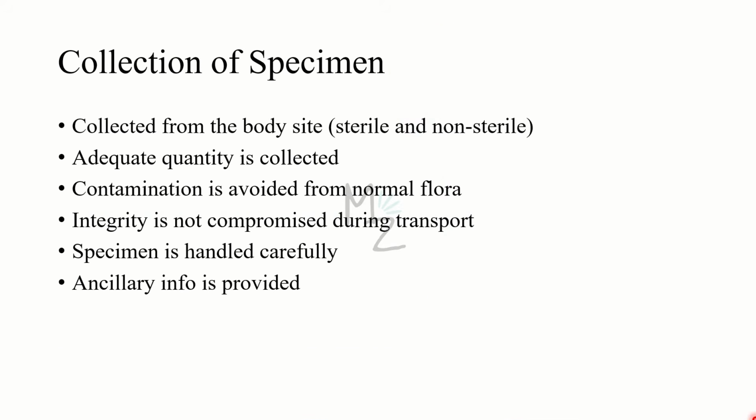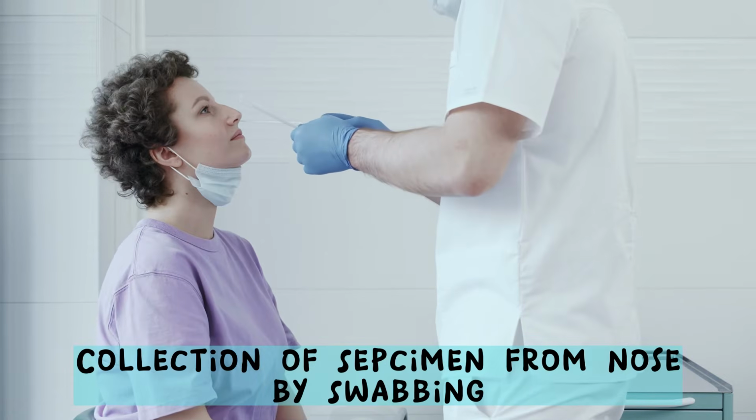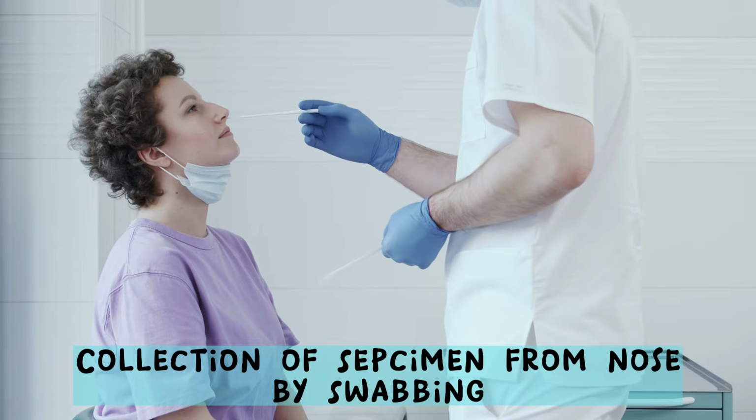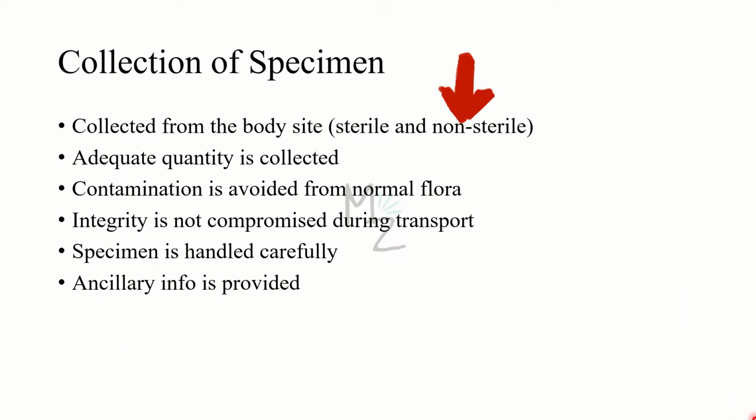Collection of specimen. The first step in the lab diagnosis of the bacteria. We'll collect a sample from the body site. There are two types of body sites. One is sterile, one is non-sterile. Sterile is something that is not contaminated with any foreign organism. If we are taking a sample from the urinary bladder, the urinary bladder is sterile from inside. There's no bacteria that is going to make this area contaminated or our sample contaminated.